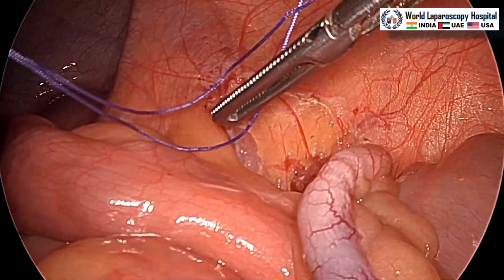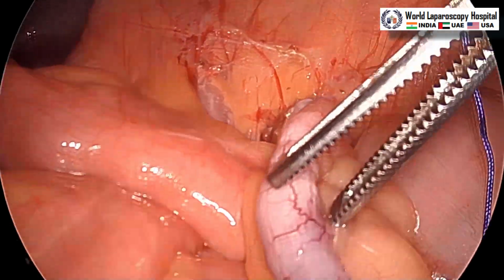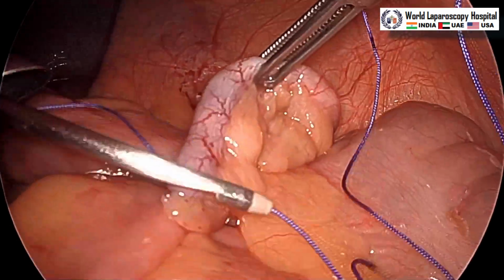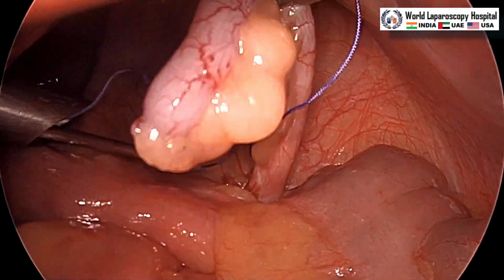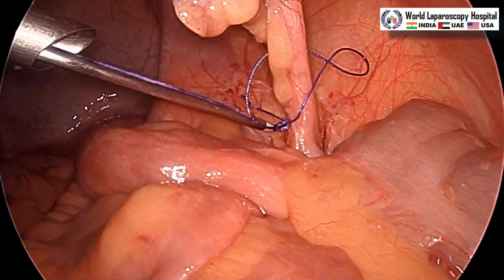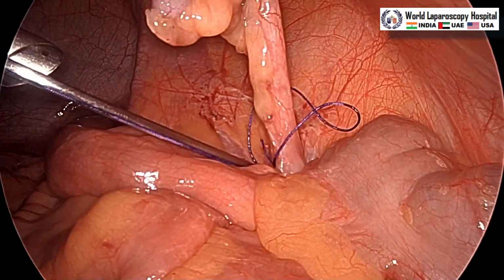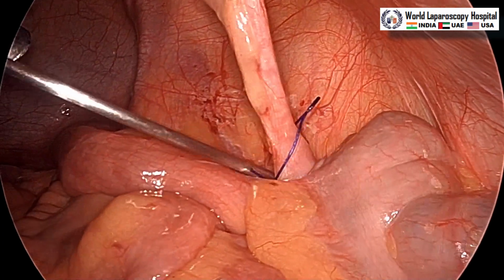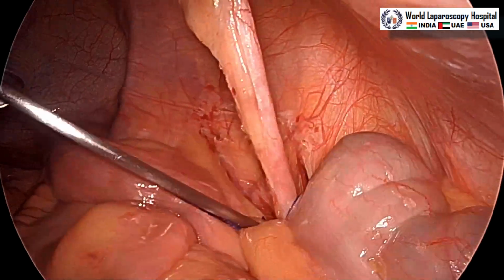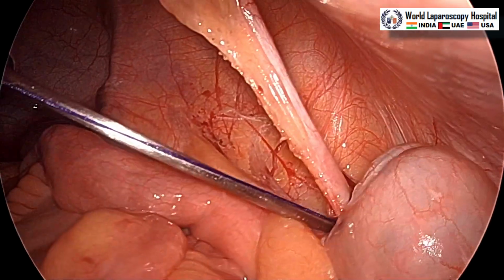And now this grasper is inside the loop, and you can catch the appendix and then negotiate this loop over the appendix. After that, slowly we should make the loop smaller, and the tip of this knot pusher should be kept as near as possible to the base of the appendix, so that there will be no incomplete appendectomy, and then you can tie the knot at the base of the appendix.